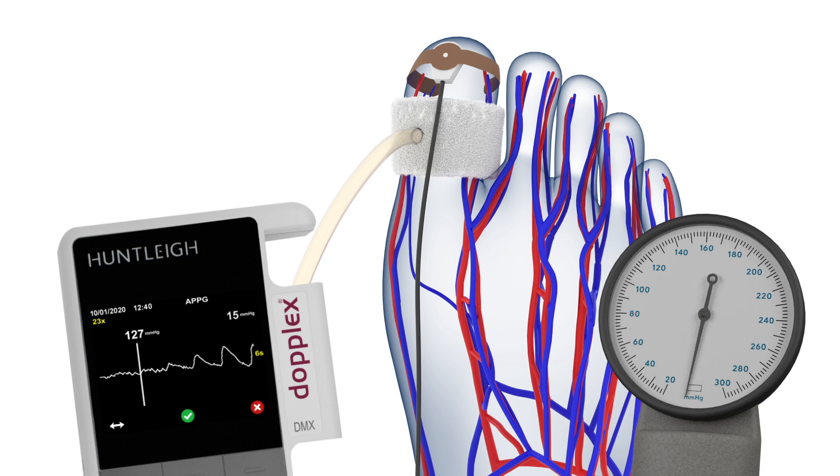When the trace stops, the first pulse represents the toe pressure. If the first pulse is not visible, scroll the trace until it aligns with the line. This is the toe systolic pressure and should be recorded.